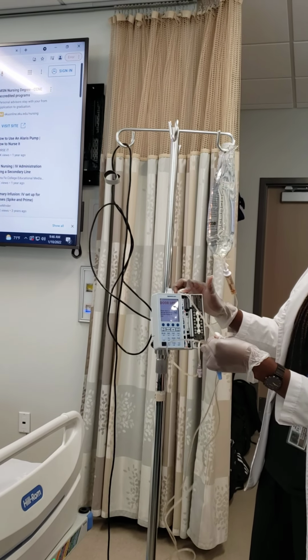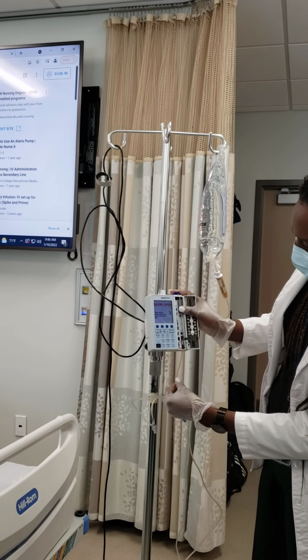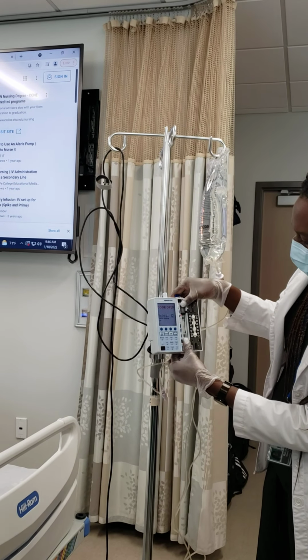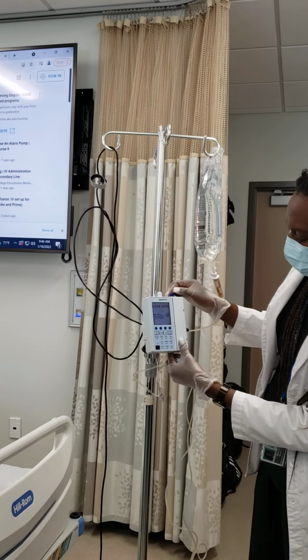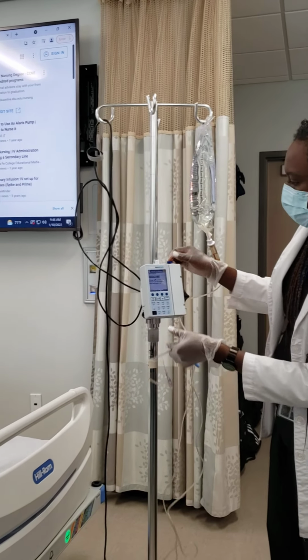So you insert it, right? Open it. You see, you just have to go down in the middle. It just tells me the door is open, but I may have to redo it. Let me see what it says. Okay, yeah, I'm going to have to. Well, actually, it's fine. Okay, all right.